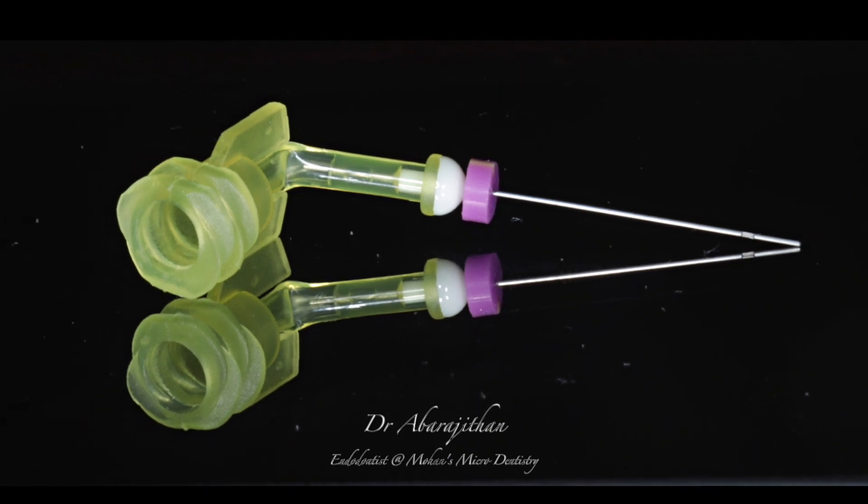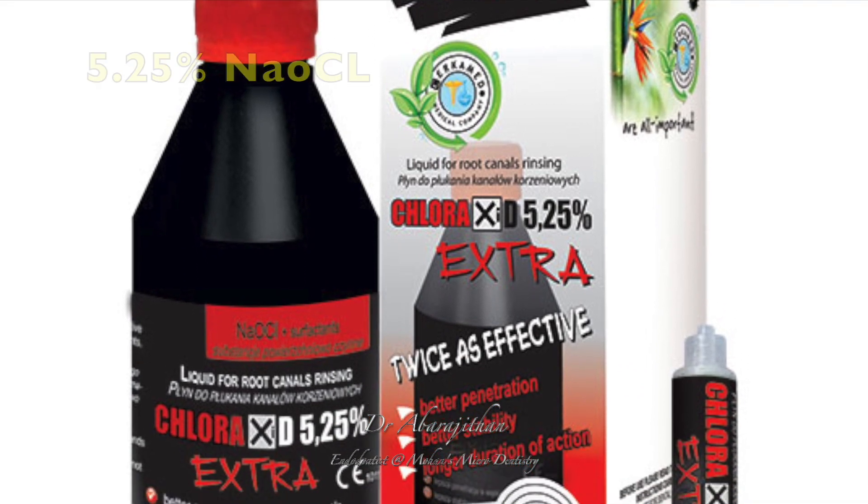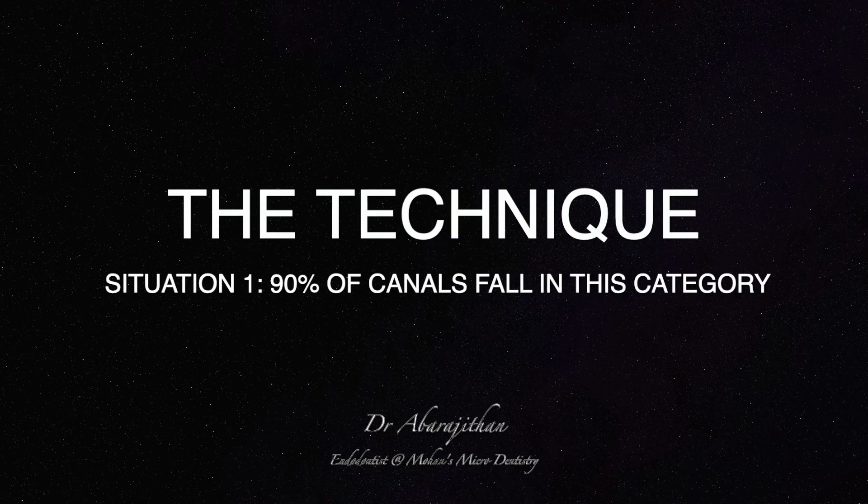A contra-angle 30 gauge needle is what I prefer. 5.25% sodium hypochlorite with a surfactant will be more effective. Let's see the technique in two different situations.